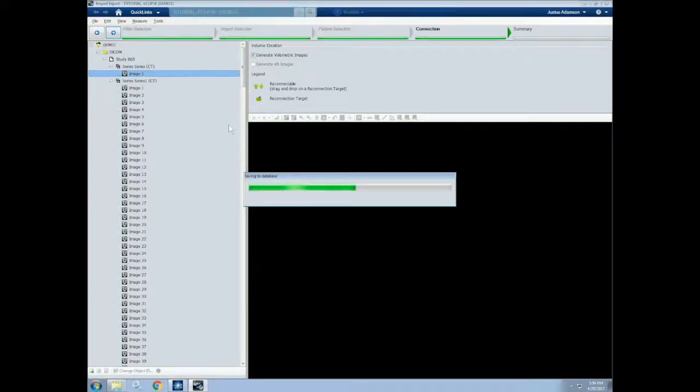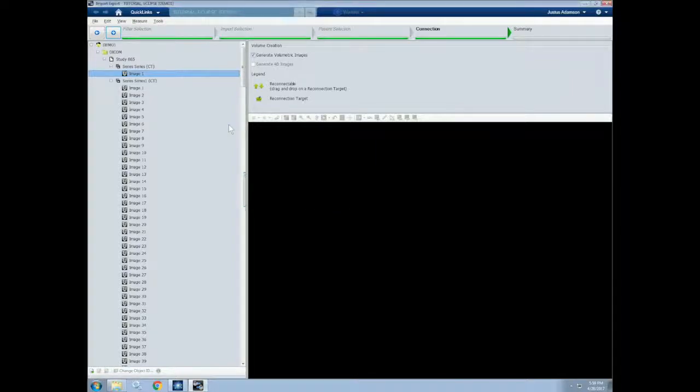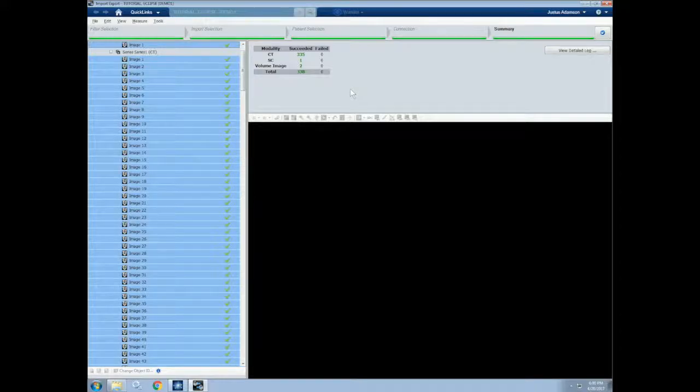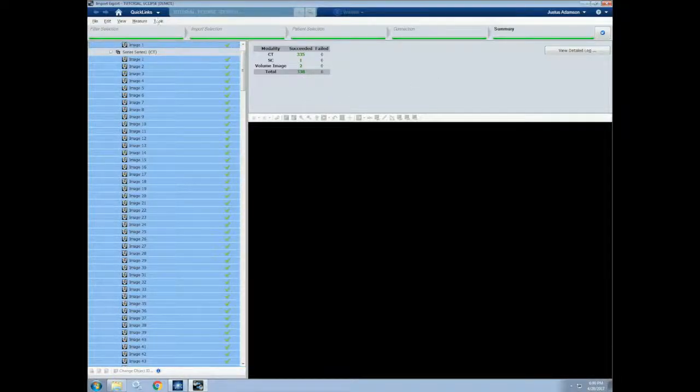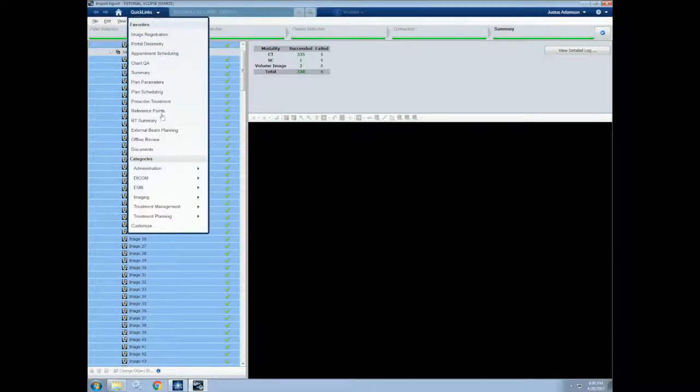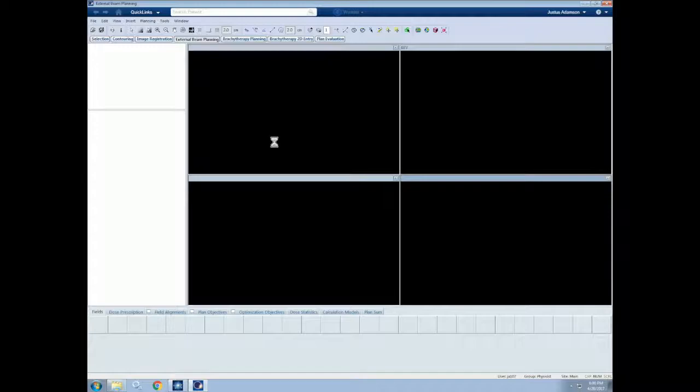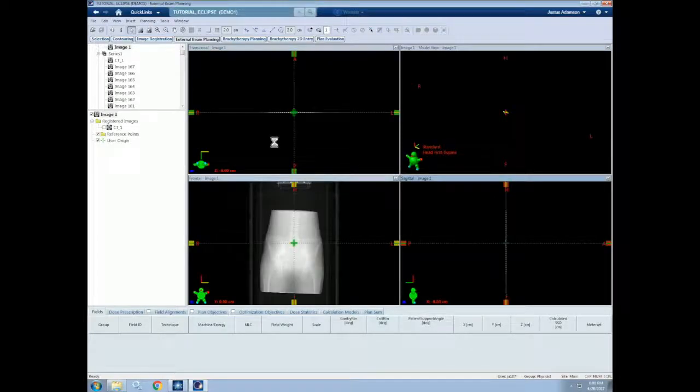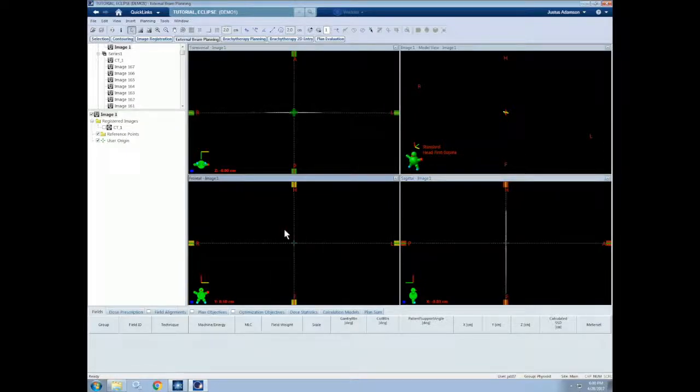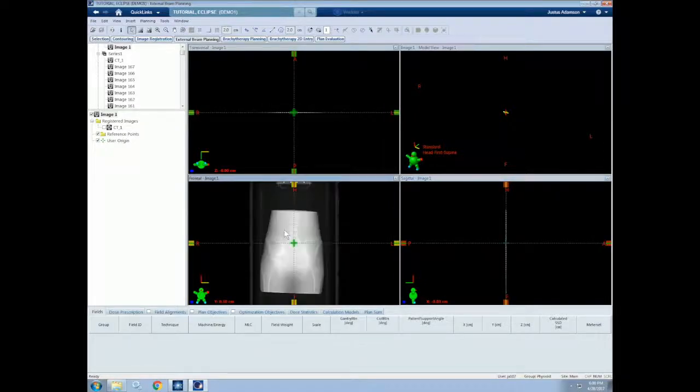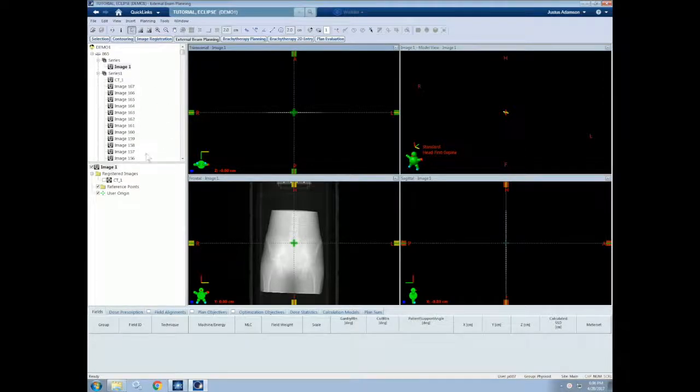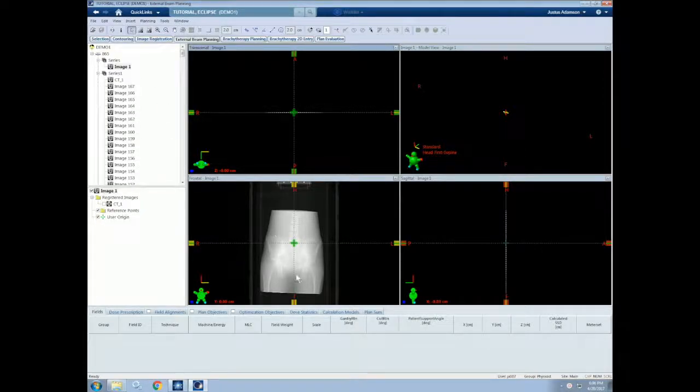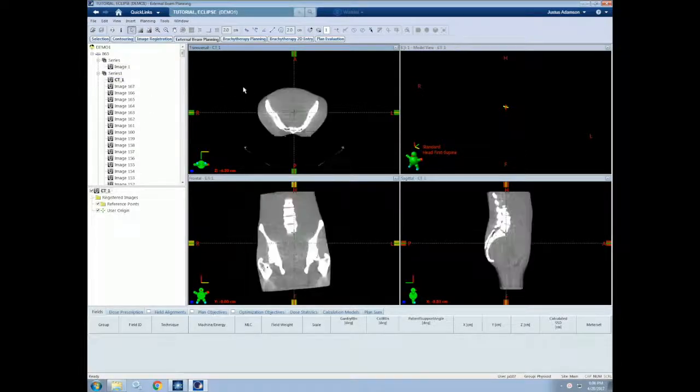Now it will save all of these images to the patient in our system. Now it gives us a summary that all of the images successfully transferred over to the patient. We can now go back to our External Beam Planning menu. All of the images that we just loaded are now here.